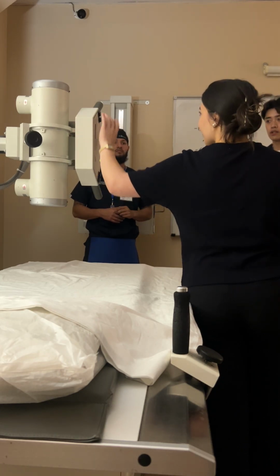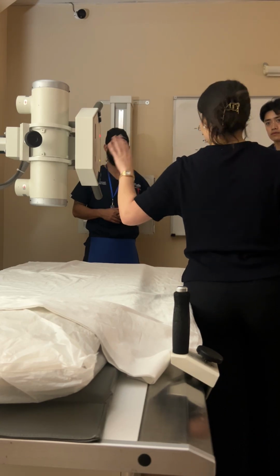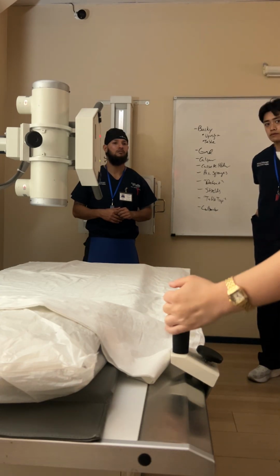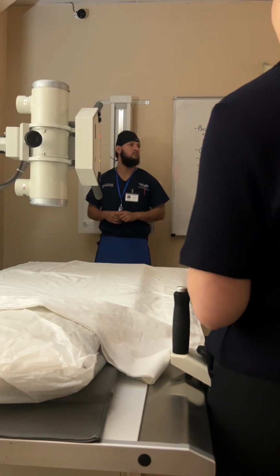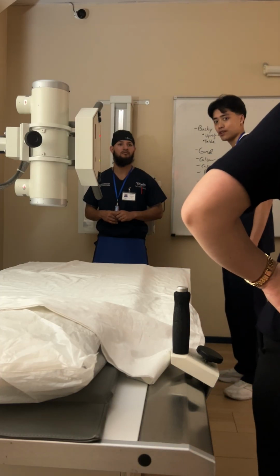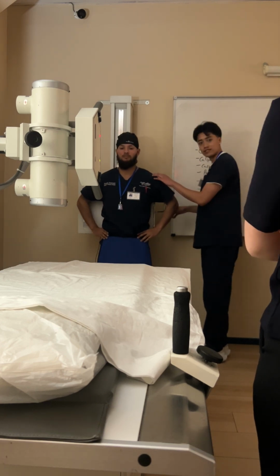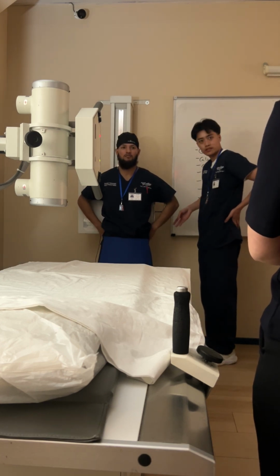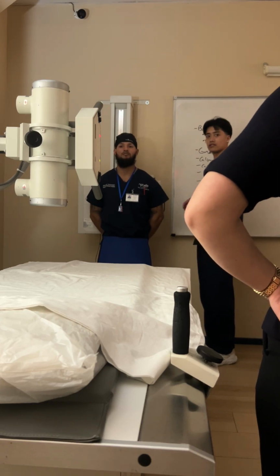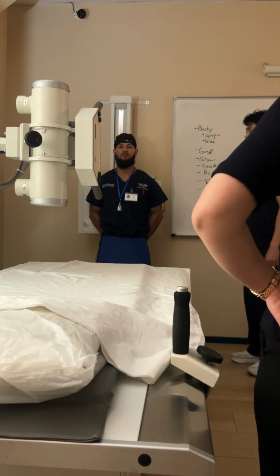Questions over here. How we doing? For left lateral position, for the marker, is the anterior side or posterior? It doesn't matter really, as long as it's on there. You'll probably see some techs who want it on the front. As long as it's on there. I mean, if it's a left marker because you're doing a left lateral, I don't care if it's back here or up here. You probably have more room if you move it to the front, though. Okay, make sense?